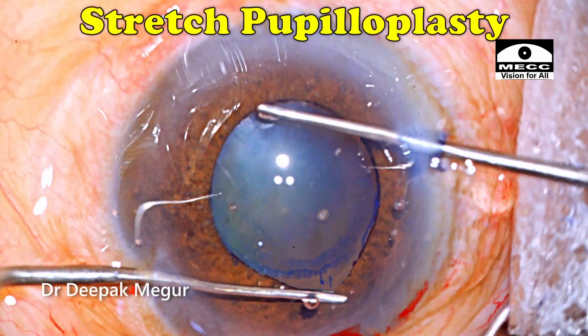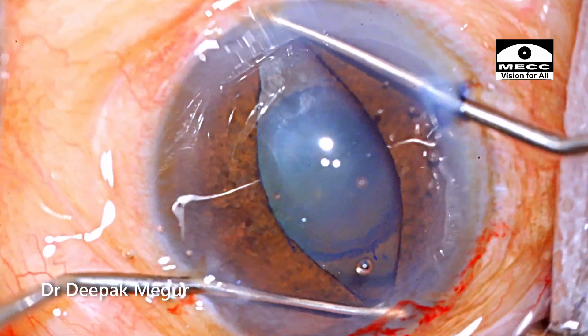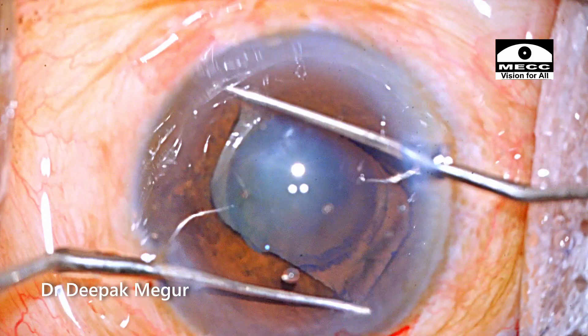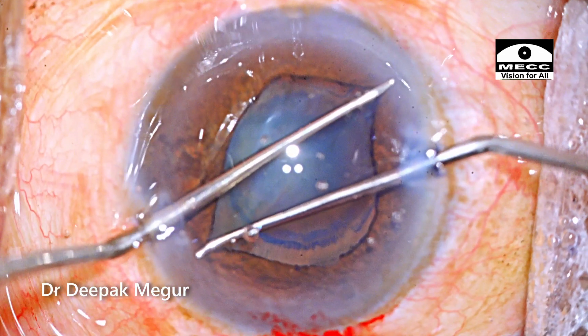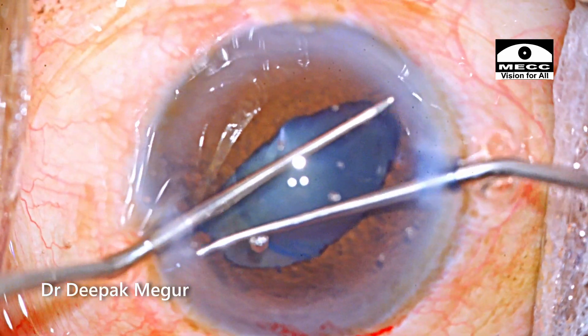Now I'm going to perform a stretch pupilloplasty. This is a rigid pupil and I'm consciously going to try to create some micro-sphincterotomies by stretching the pupil to ensure that the pupil remains in an expanded position until the end of the surgery. I'm using Y-hooks to do the same. Typically I do this expansion in four meridians.